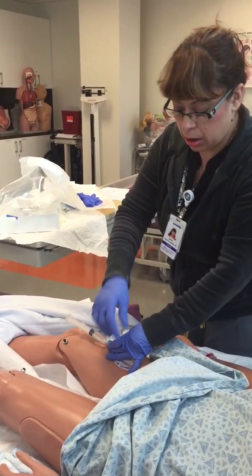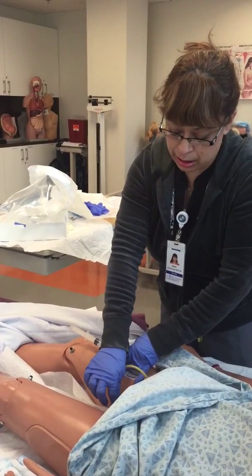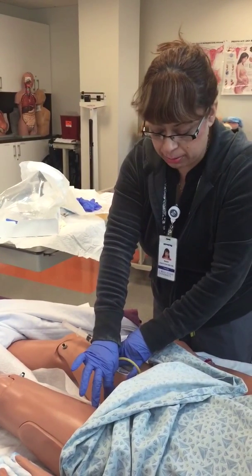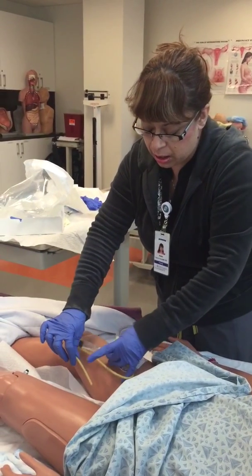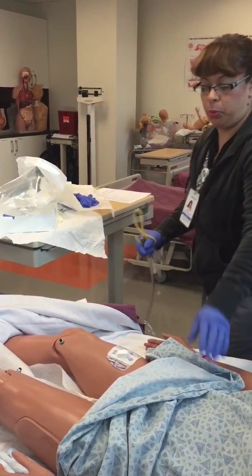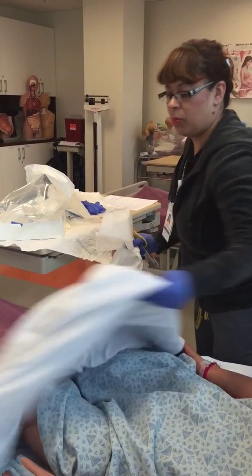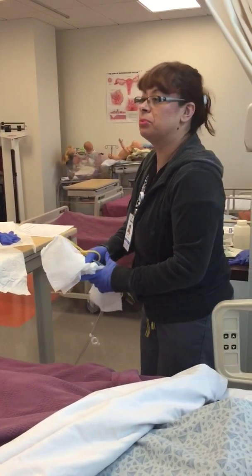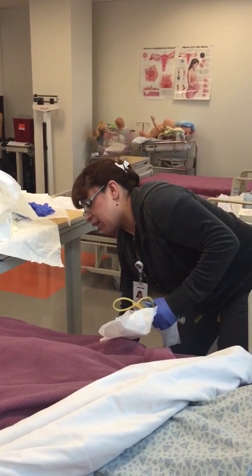Let Mrs. Smith know that if she bears down, it helps. It causes this to relax. She could either bear down, or tell you it might be just a slight little tug feeling down here, and then bring this out and dump it in the appropriate container. And then once again, you're going to document. Okay? So that's it. Pretty simple. So that's that with this one.